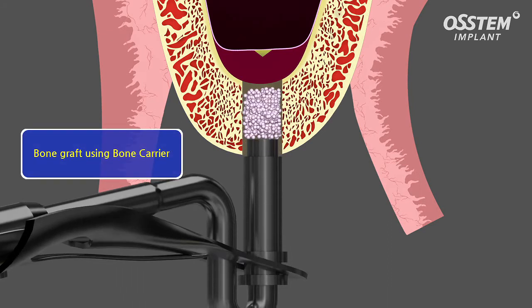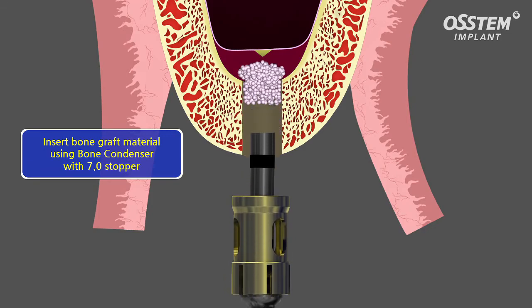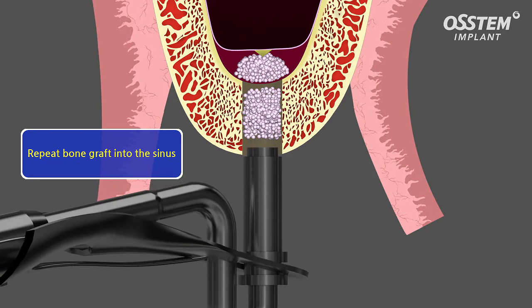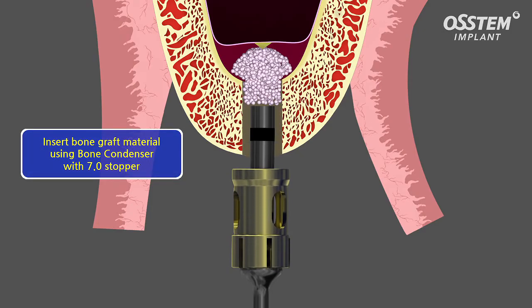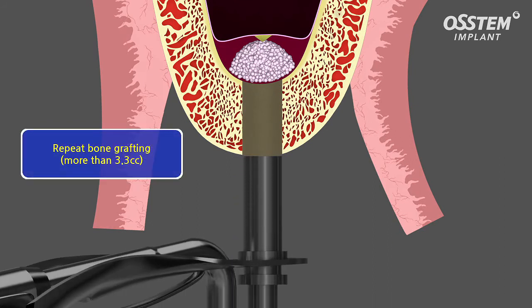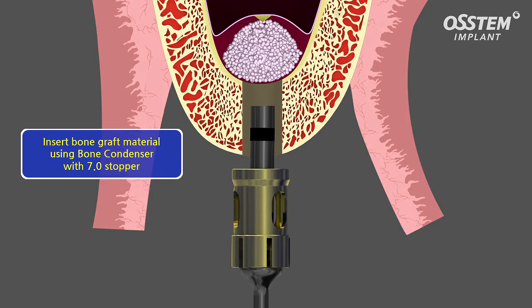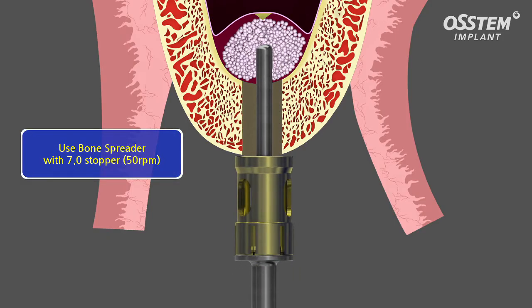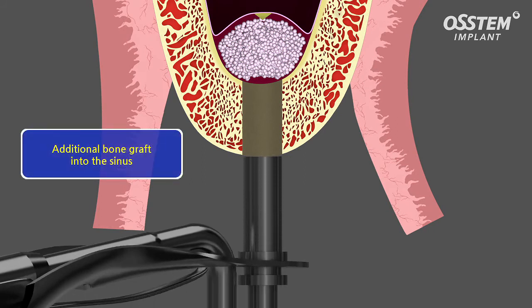The bone graft material is being filled into the sinus with the bone carrier. A 7 millimeter stopper is being connected to the bone condenser and the bone graft material is being pushed further into the sinus. The procedure has to be repeated until the cavity in the sinus is filled up. The bone graft material is then spread in the cavity by using the bone spreader with the 7 millimeter stopper at 50 RPM maximum.